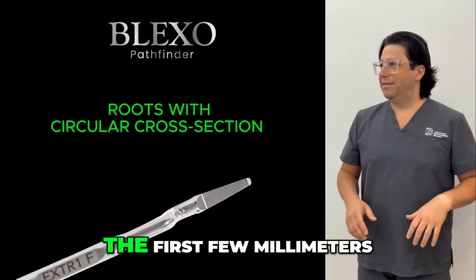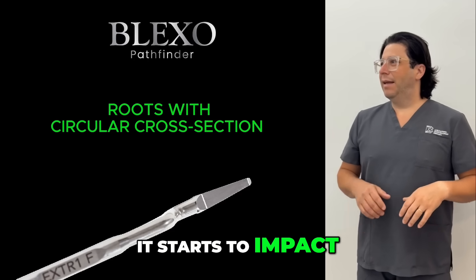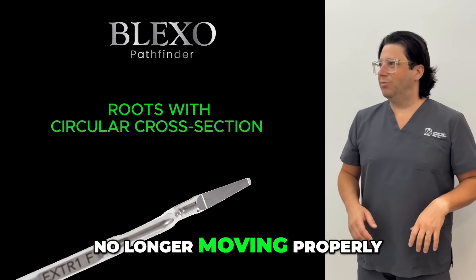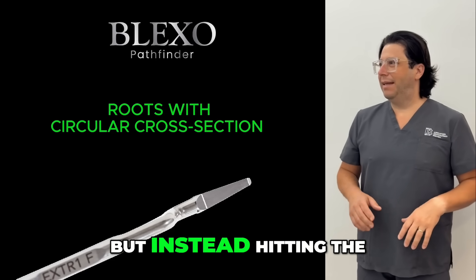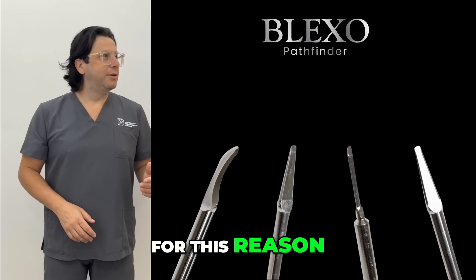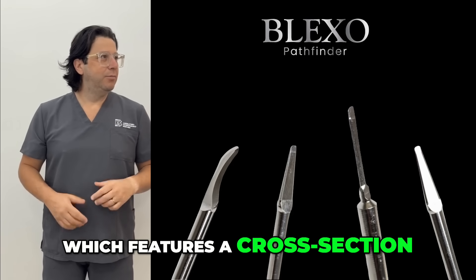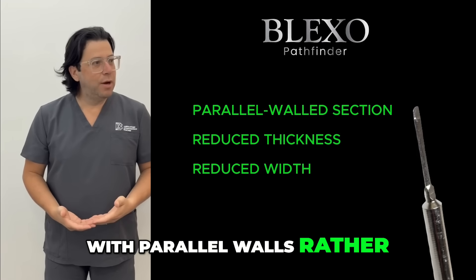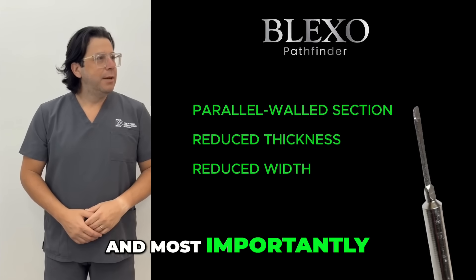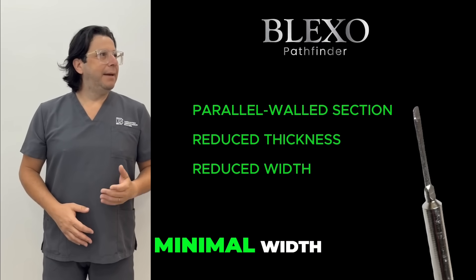This means that after the first few millimeters of penetration, it starts to impact against the bony surface of the socket, no longer moving properly within the periodontal space, but instead hitting the lateral bony walls. For this reason, the BLEXO Micro was developed, which features a cross-section with parallel walls rather than triangular ones, and most importantly, it has both a minimal thickness and a minimal width.